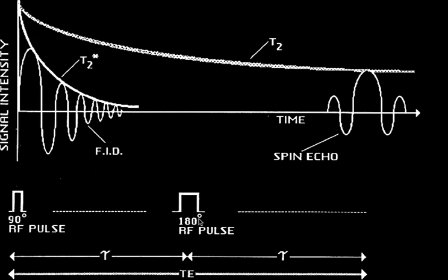But once it goes into the XY plane, is the bulk magnetization not quickly coming back down from the XY plane into the Z axis? Again, remember that there are two components. First, the XY goes down to 0, and then the Z grows up in the Z direction.